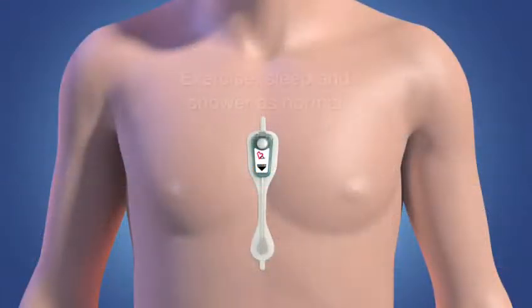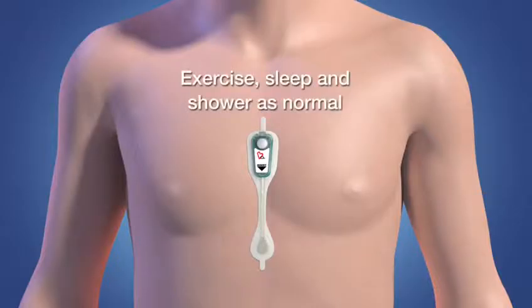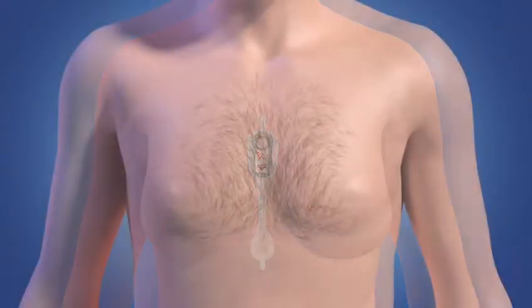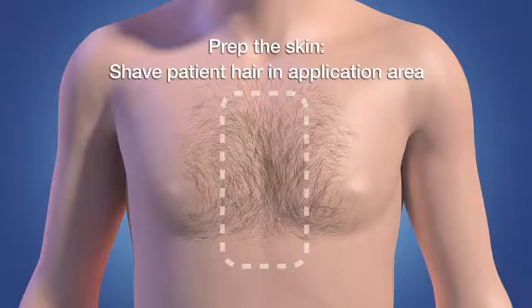The patient can exercise, sleep, and shower, only being careful not to submerge the CAM or expose it to excessive moisture. The CAM is also specifically designed to be comfortable for women with its narrow hourglass shape discreetly positioned between the breasts. Males must be clean-shaven with no visible signs of stubble.